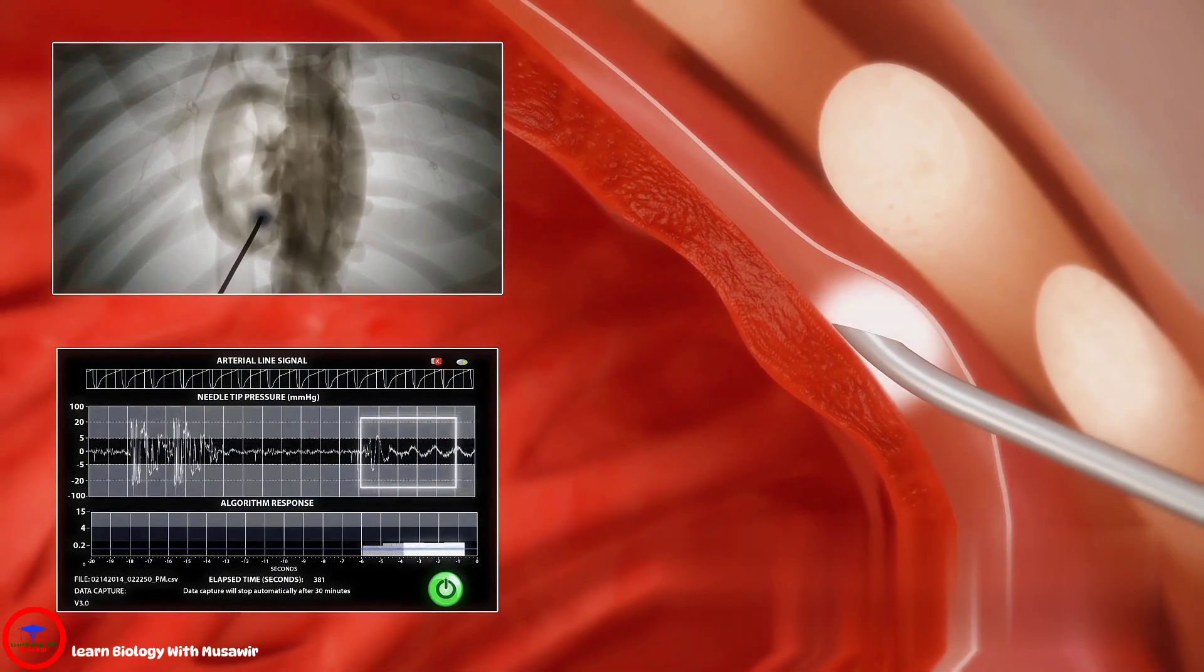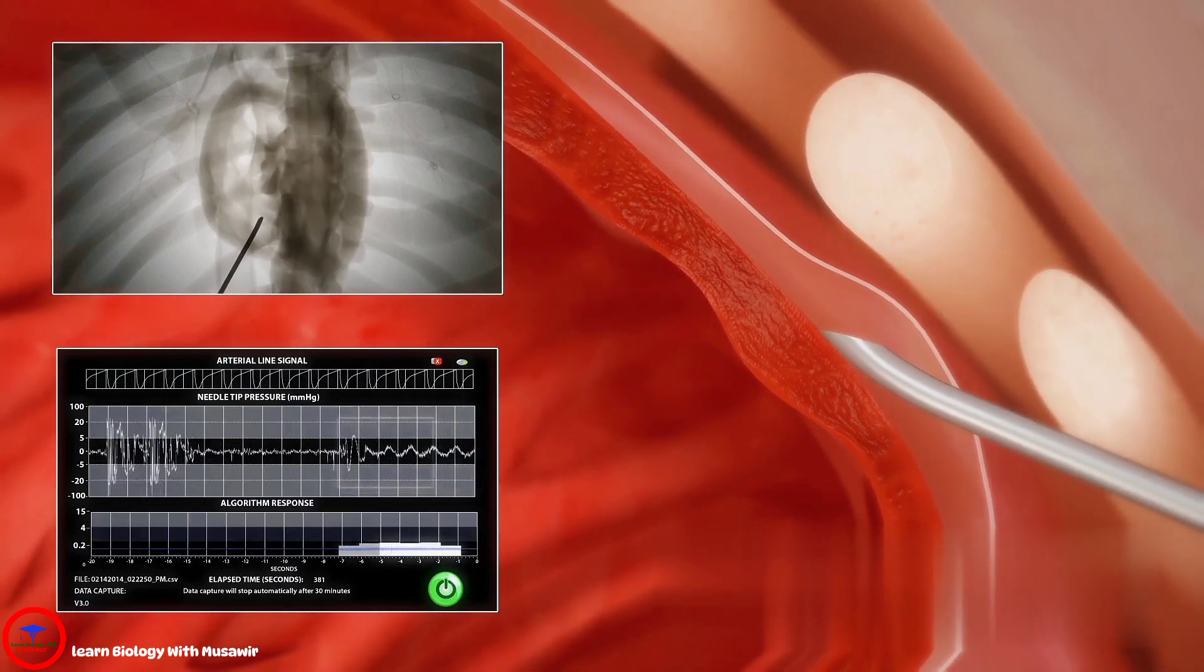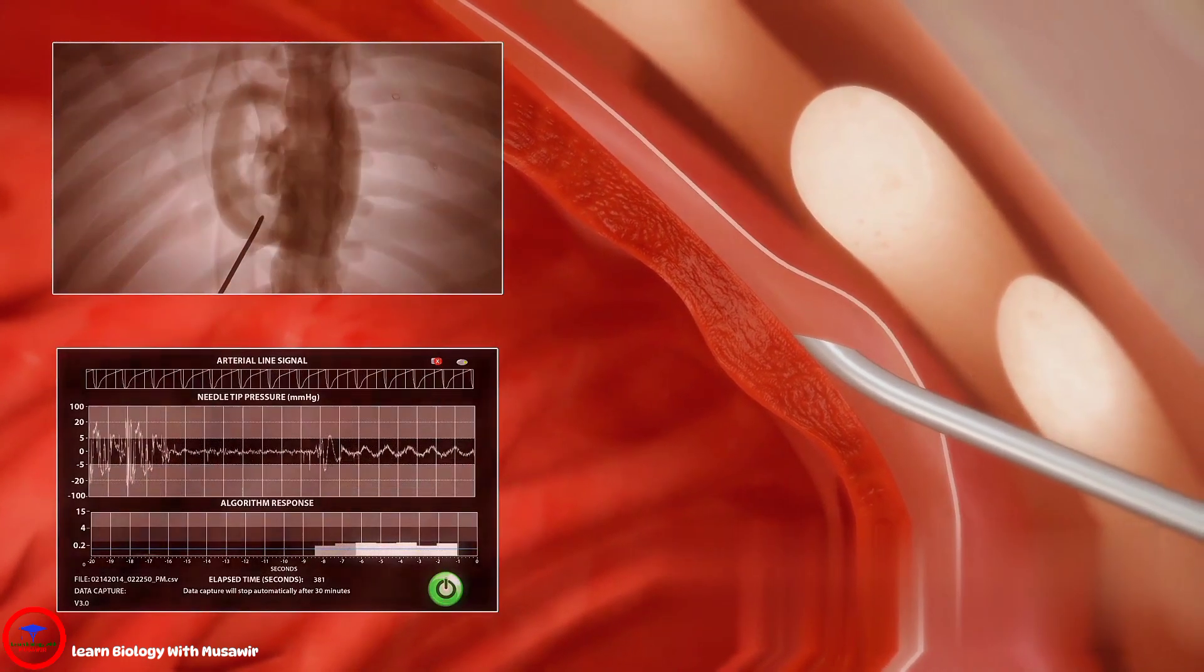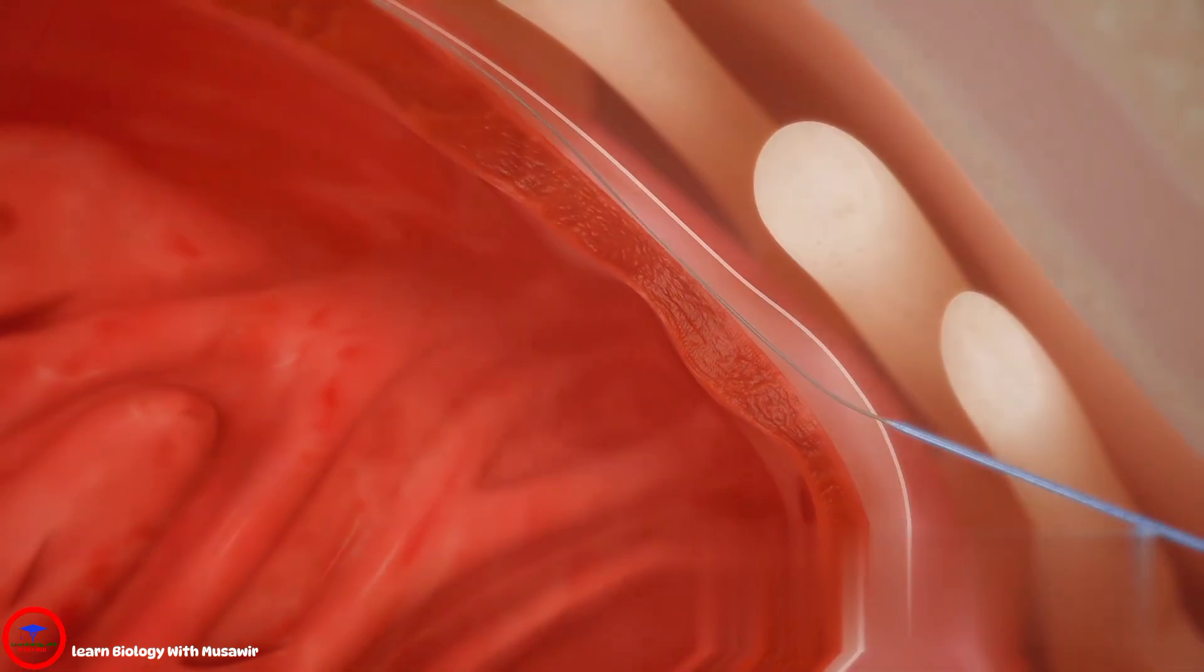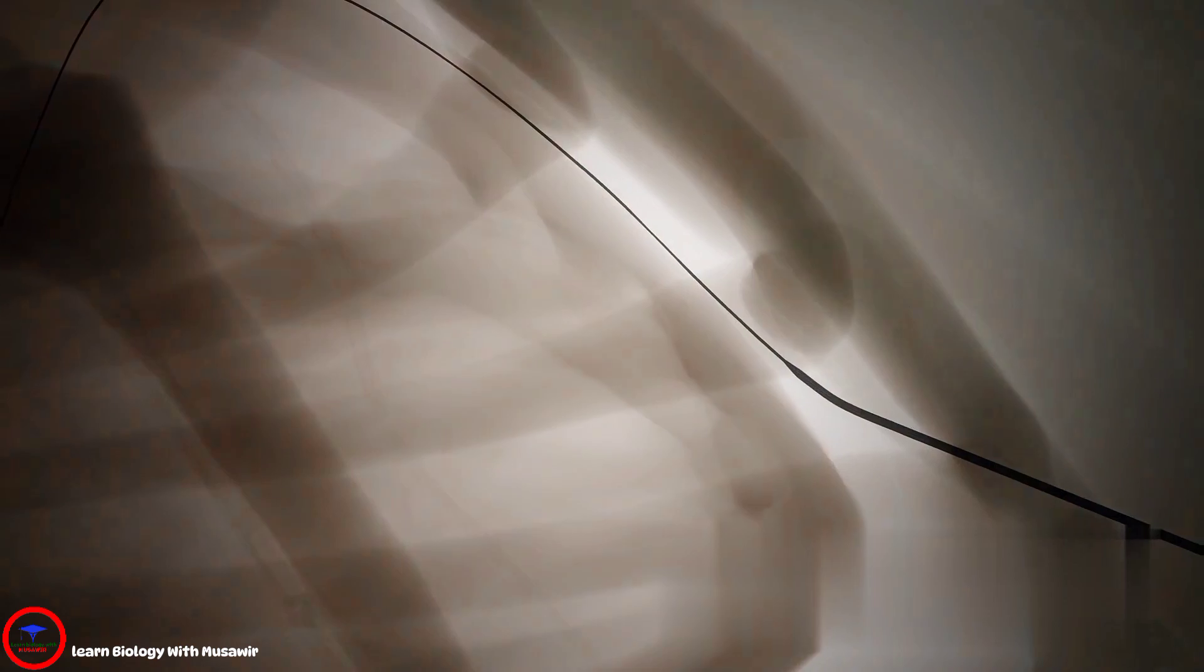Access is confirmed with a second puff of contrast under fluoroscopy. A guide wire is extended into the pericardial space, the needle is removed, and a sheath is introduced to allow epicardial access.